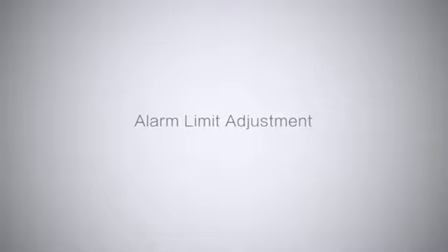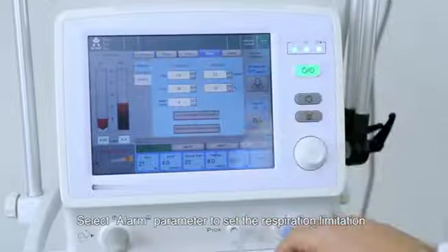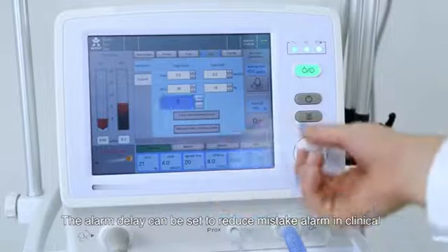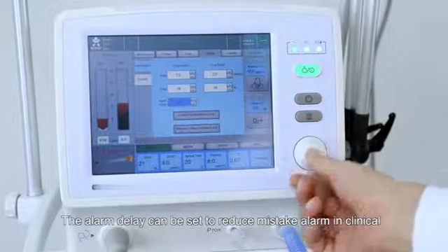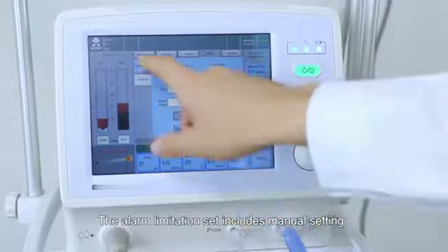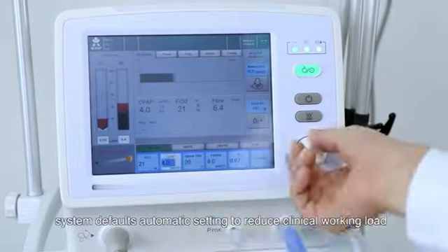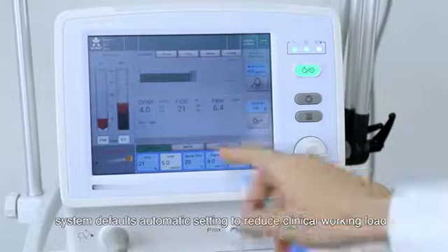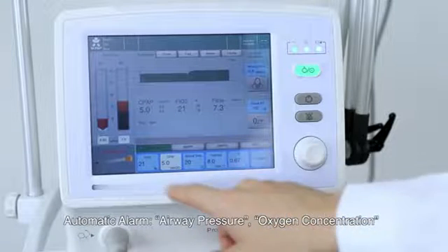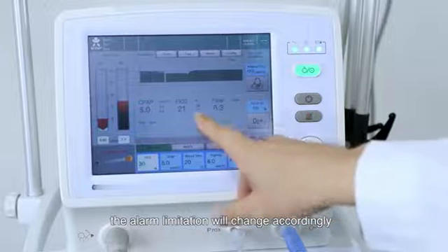Alarm limit adjustment. Select Alarm parameter to set the respiration limitation. The alarm delay can be set to reduce mistake alarm in clinical. The alarm limitation set includes manual setting and automatic setting. System defaults automatic setting to reduce clinical working load. Automatic alarm: when airway pressure or oxygen concentration change, the alarm limitation will change accordingly.